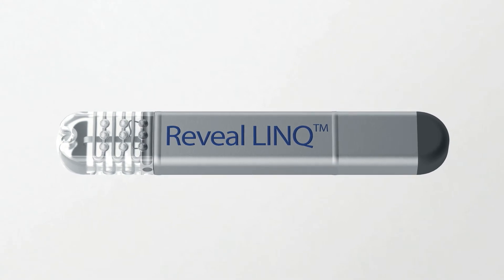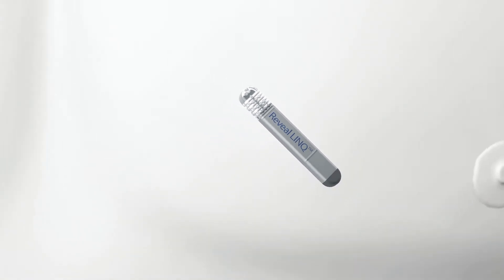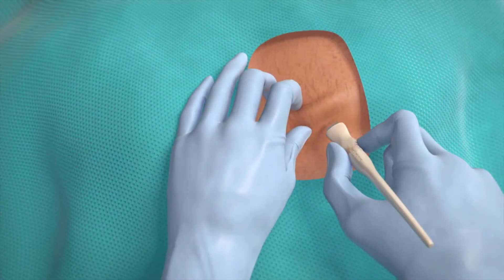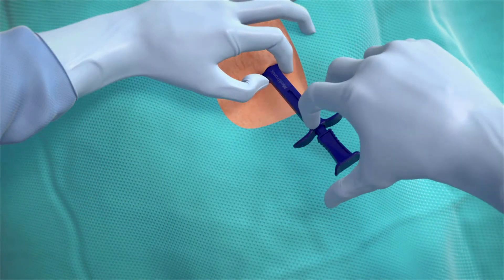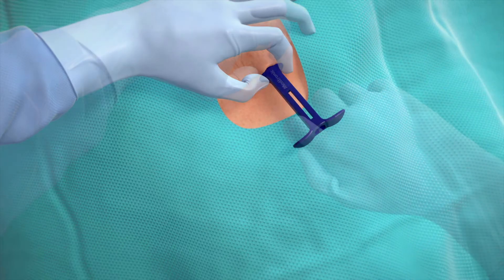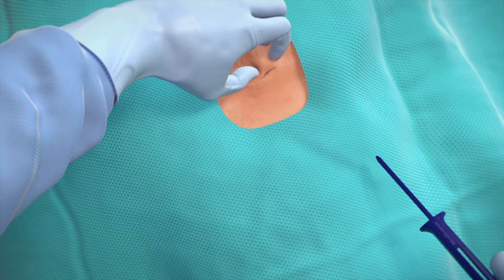The Reveal Link ICM is the smallest of its kind. This tiny device is inserted just under the skin during a short outpatient procedure. Your doctor will pinch the skin and make an incision of less than one centimeter. Then, using a specifically designed tool, the Reveal Link is inserted just under the skin. Once in position, the insertion tool is removed and the incision is closed.